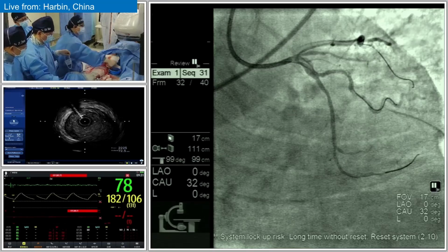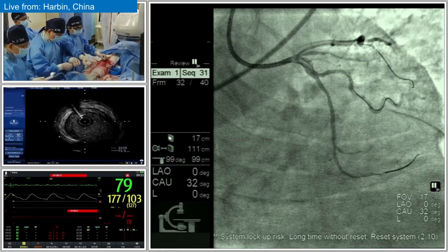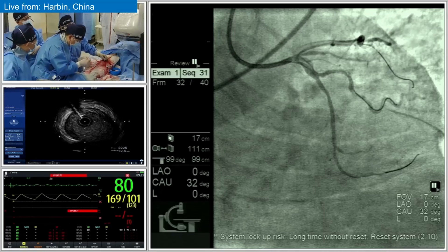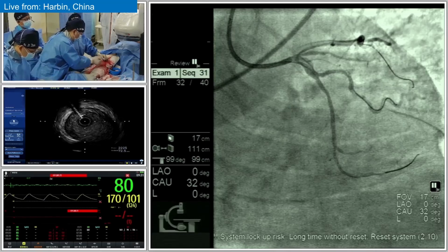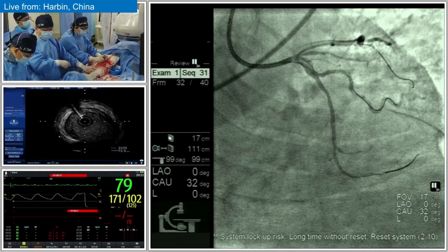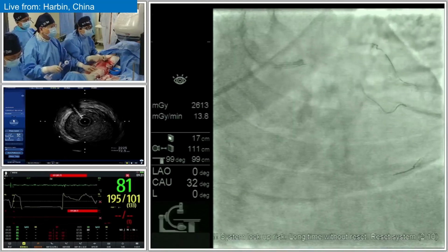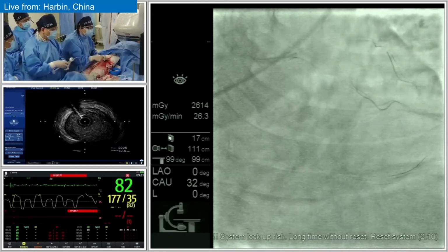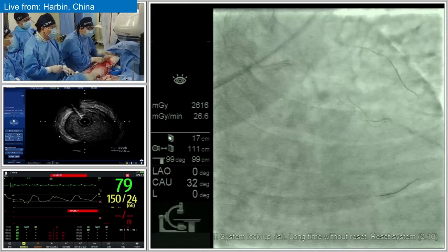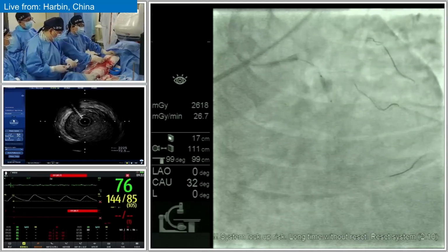So Dr. Gong, after the use of the cutting balloon, you will use some NC balloon for further dilatation? Yes, after NC balloon dilatation, we will perform intravascular imaging again to help us decide the next step, DB or DS. Both are a good choice. You haven't decided yet, right? Yeah, it could be DB or it could be DS.